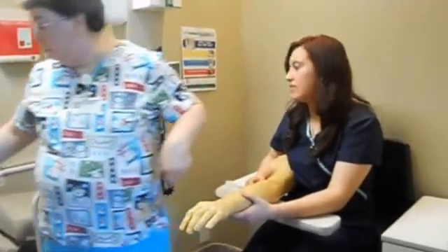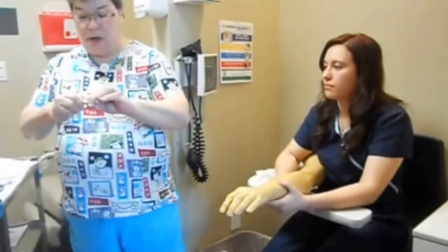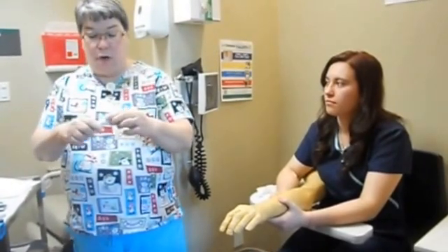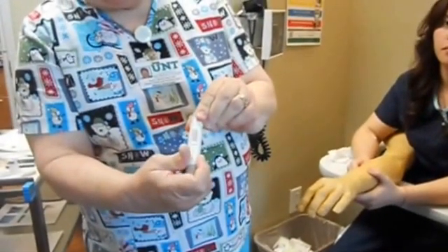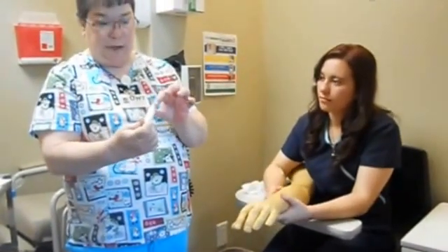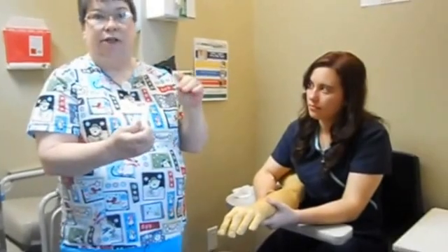There are several different devices. This is one where you just take this off right here, you cock it, and then put your finger there and push this right here, and the blade comes down and pokes your finger. This is one that comes with a glucometer. You open this part up, and this is how most glucometer pokers work. They have settings. Right now this is set very deep, or you can rotate it and it gets shallower. So depending on who you're using it on, if it's somebody like Sam here who doesn't get finger sticks, I'm not going to use a deep cut. I'm going to use a shallow cut. But if I were to use it on myself, I'd use a deep cut, because I do finger stick glucoses on myself all the time.